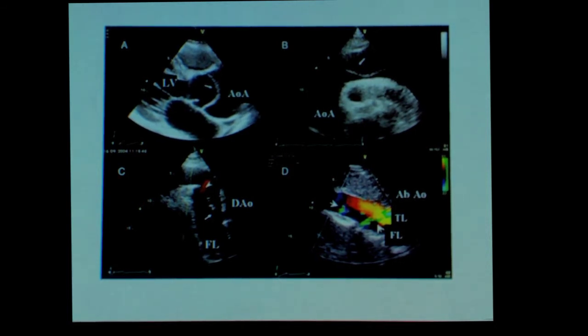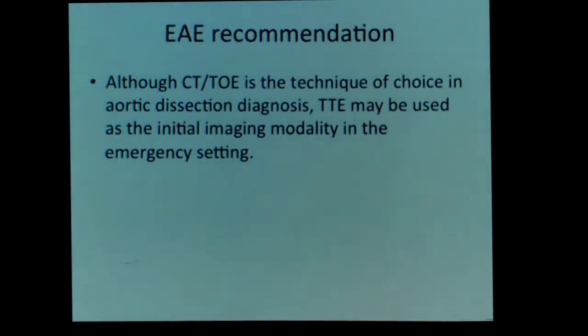Sometimes when you can't get that one, you get it from the supraclavicular on both sides, or just under. Really, you go supraclavicular? Oh, I've never tried that. Yeah. Well, okay. I'm sure it has so much to do with anatomy, where the heart actually is, right? In some patients the heart is so displaced towards the diaphragm, you can't really get a parasternal view at all of anything, right?